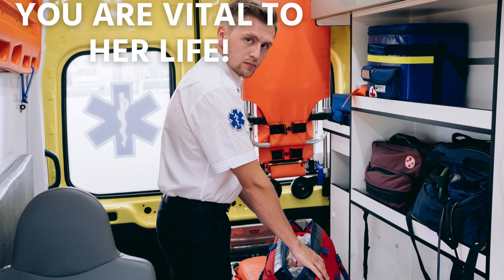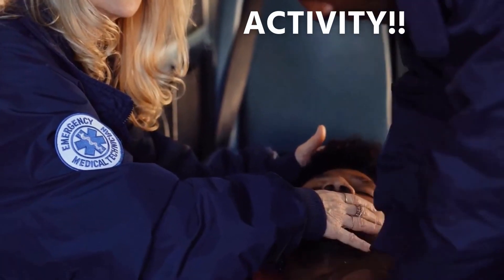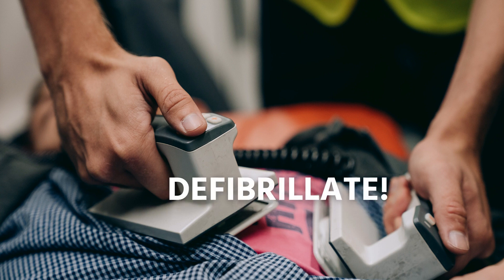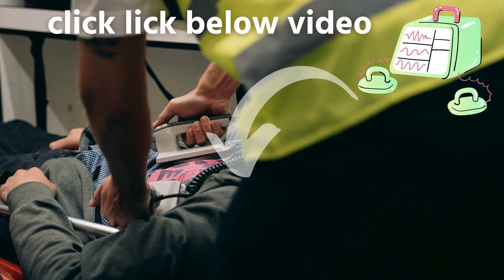For every minute that this woman in cardiac arrest goes without being successfully treated by defibrillation, the chance of survival decreases by 7% in the first three minutes. So take action immediately. Start early.